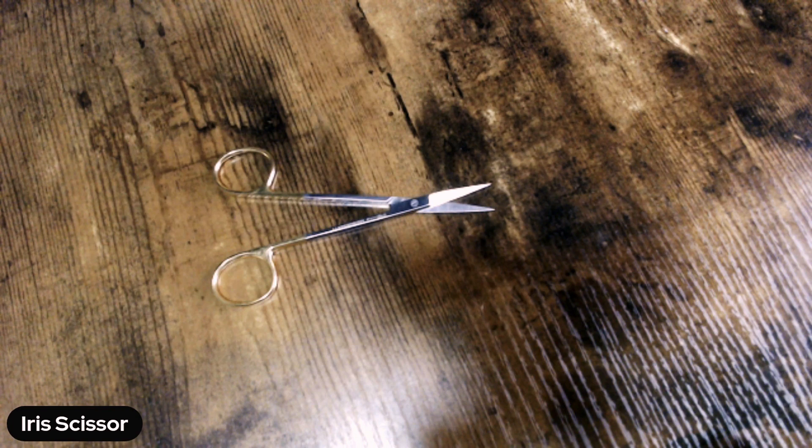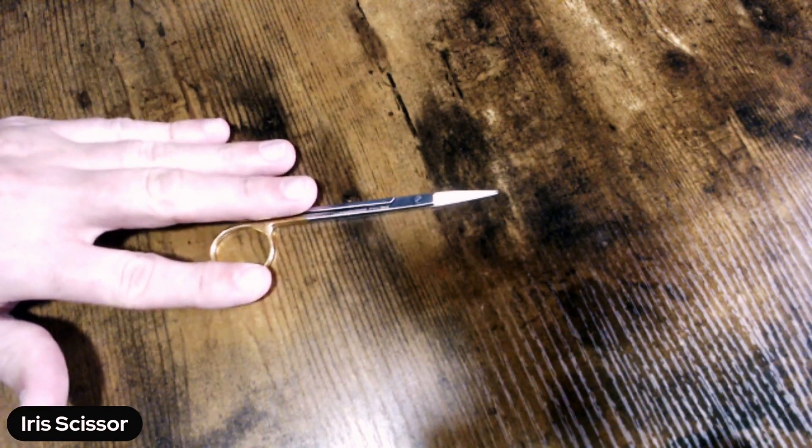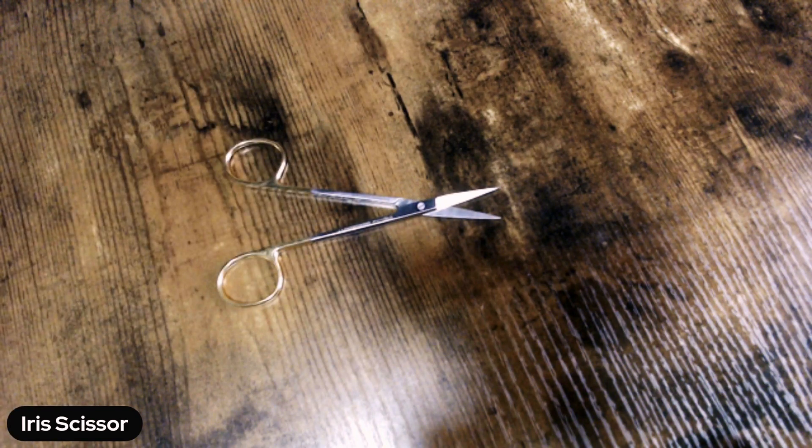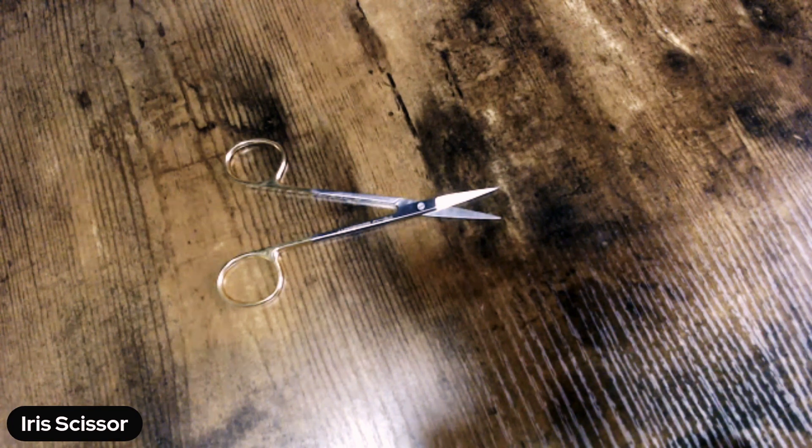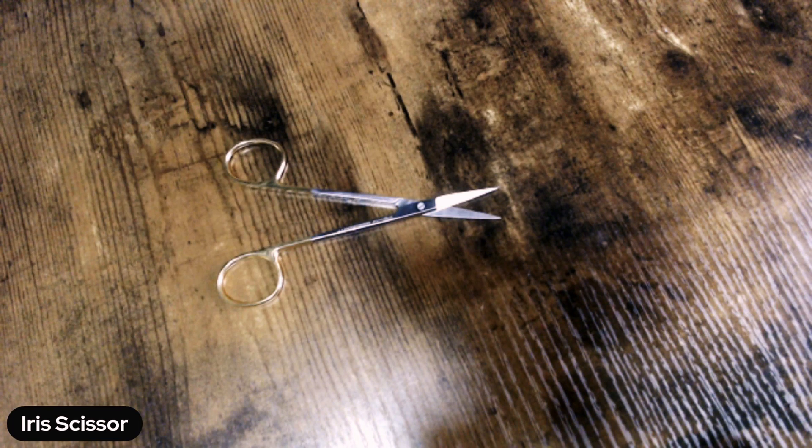But keep in mind, you do not want to be making any quote-unquote homemade repairs to your instruments. Only send that device out to a licensed manufacturer or a licensed repair technician to make any changes, even something as simple as tightening the screw.